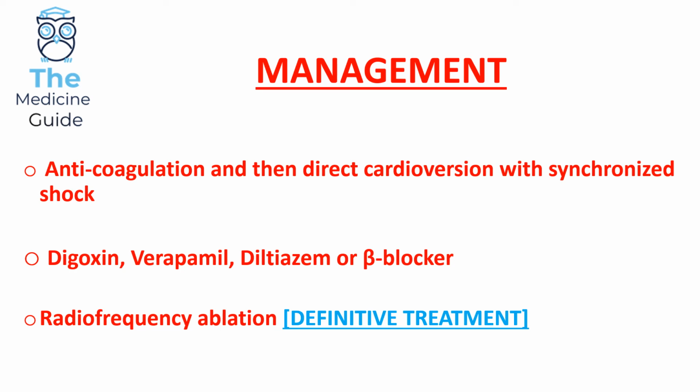However, I do think the management of atrial flutter is something that they could quite easily ask you as the special question in an OSCE, so just be familiar with the management plan of atrial flutter. But the key thing to remember in terms of the topic of atrial flutter is being able to interpret the ECG and also being confident in interpreting the type of AV block that's occurring in a patient presenting with atrial flutter.